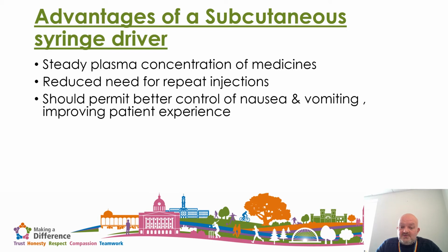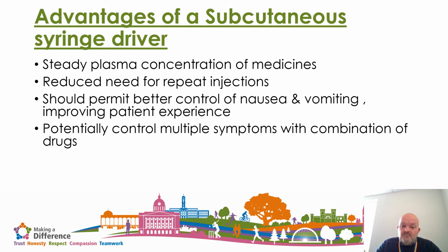It is going to provide better symptom control for things like nausea and vomiting, because we know that by giving the medication subcut through the syringe driver, the patient is going to get the dose that we want them to get. And equally, because we use a number of drugs in one syringe, that could hopefully control multiple symptoms with just one syringe driver.